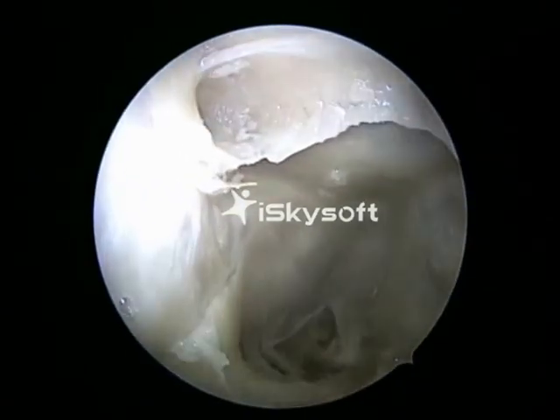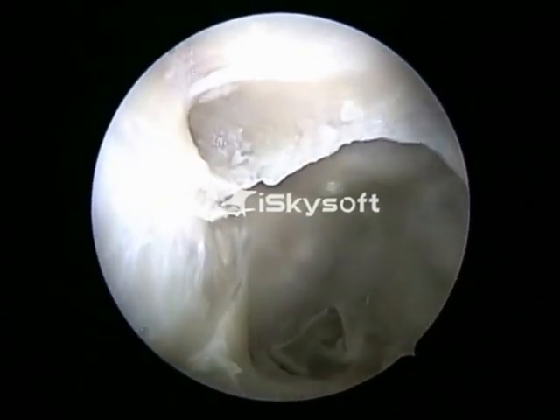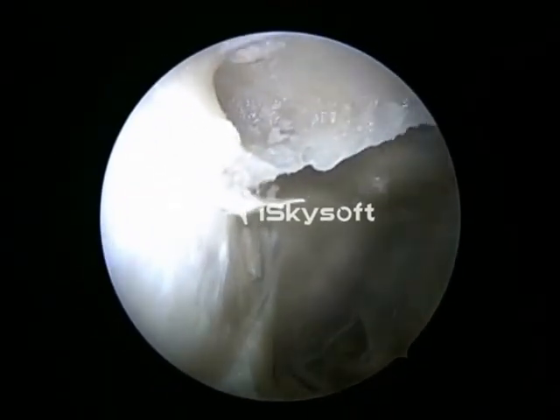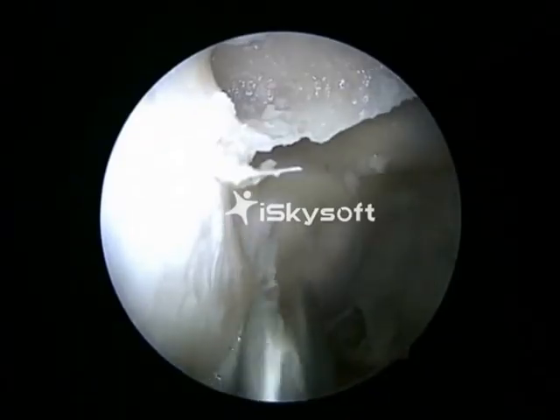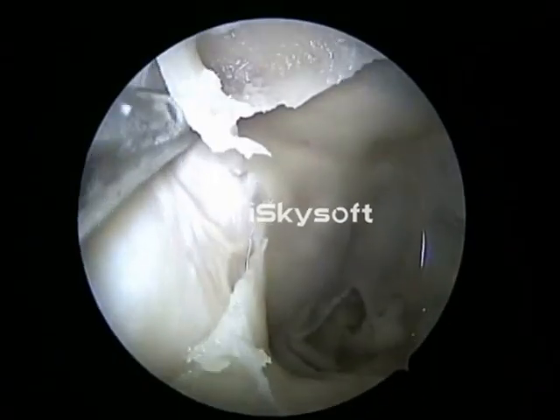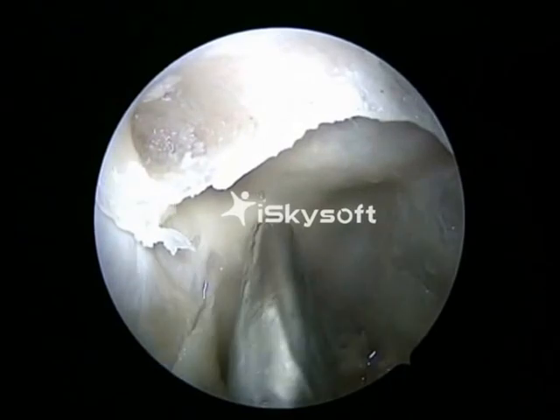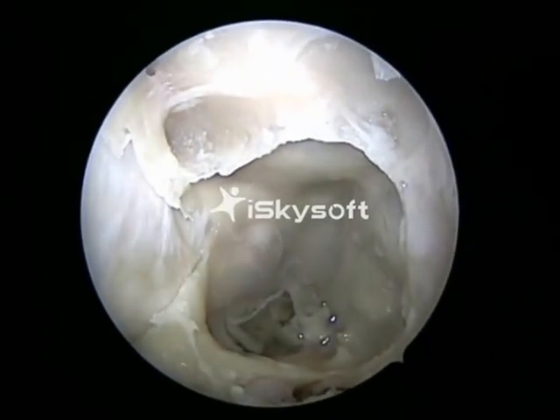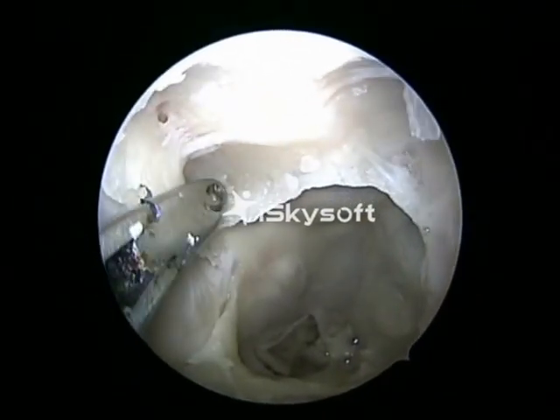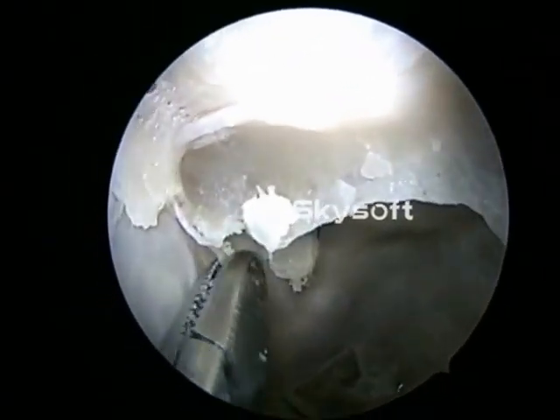That's the optic nerve. The bone is being removed from its medial wall. That's in fact the bony canal surrounding the optic nerve. The optic nerve has got a length of around 1.5 to 2 centimeters in the sphenoid sinus. In an onodi cell situation, the optic nerve could be dehiscent, and during dissection we should be very careful, and the optic nerve can be easily damaged if we don't read a CT scan properly.